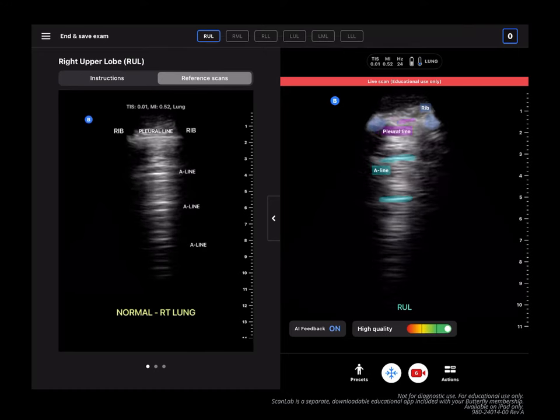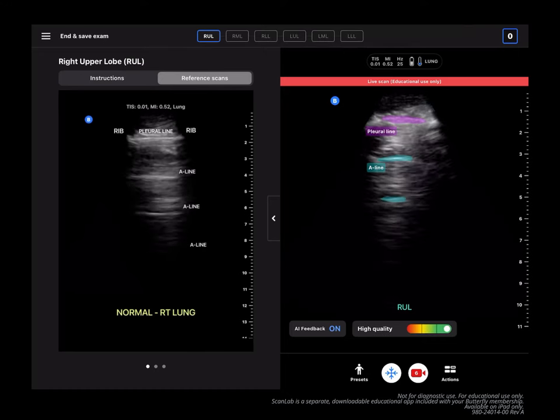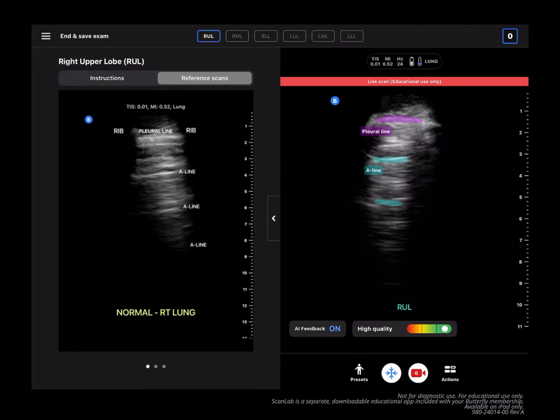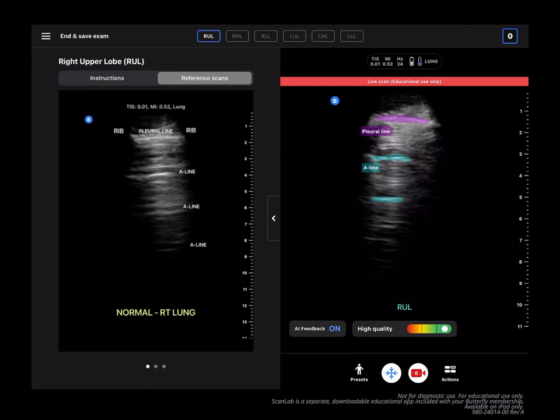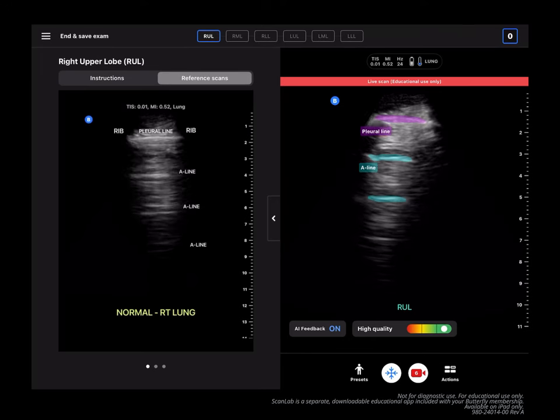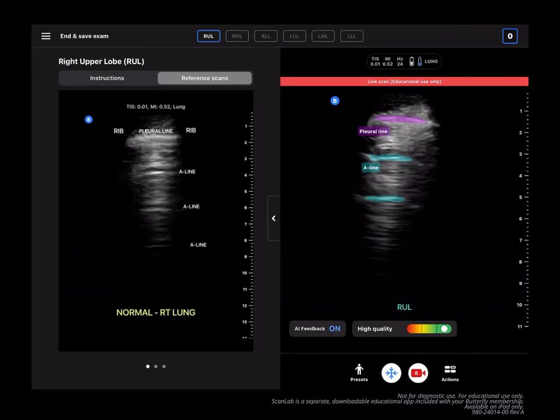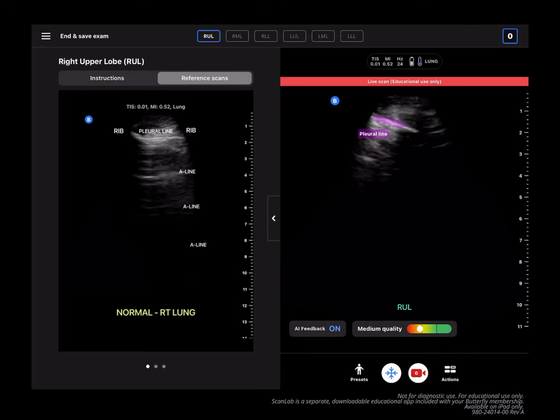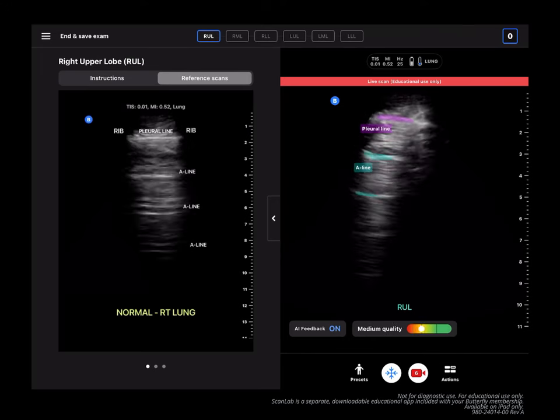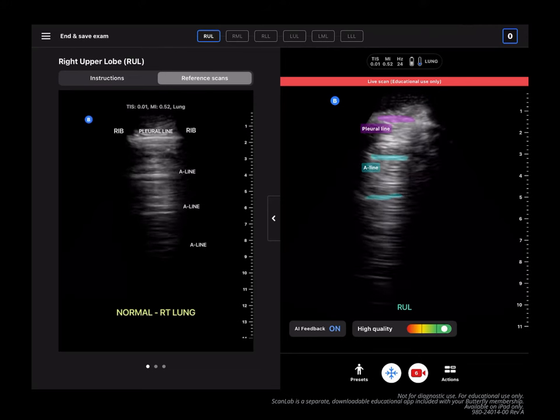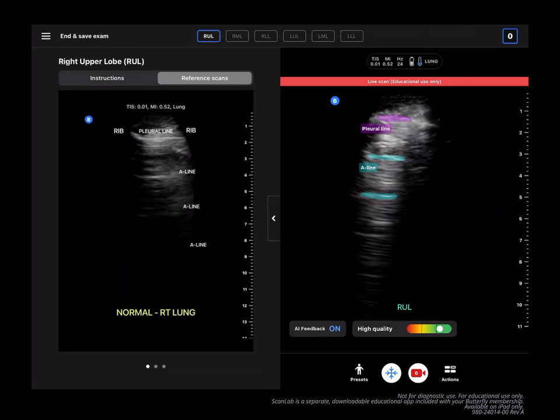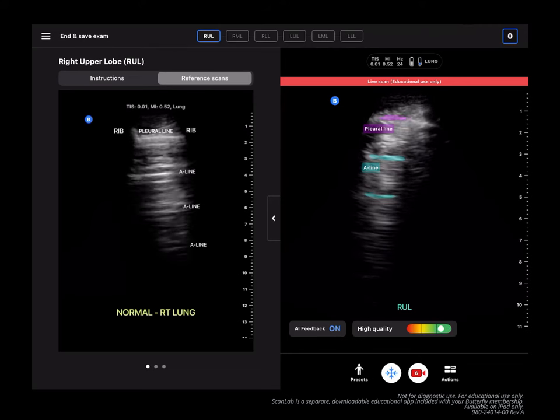As I begin to scan, anatomical labeling helps me identify the anatomy I'm seeing. At the bottom, you can see the quality indicator bar move from low quality to high quality to dynamically provide feedback on the quality of my image as I scan.